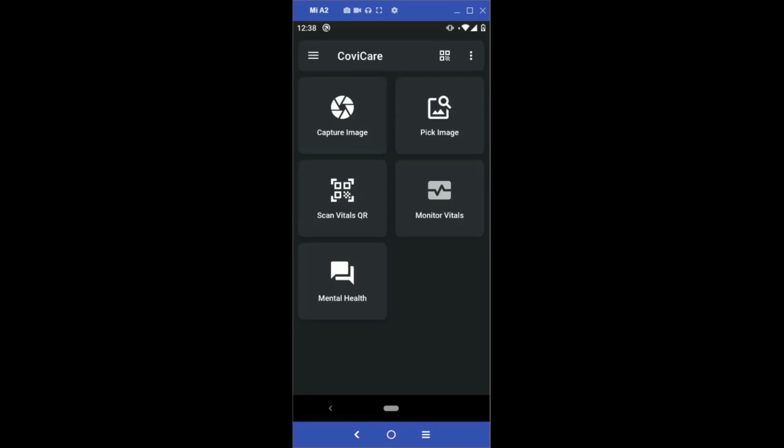The detailed results are mentioned in the PPT further. The trained model is then converted into a .tf-lite format for easy deployment on the smartphone. The final model size is 11.4 MB. Now we will continue with the demonstration. So on the home screen, you have the option to pick an existing CT scan image or capture a new image. I will click on the pick image option.